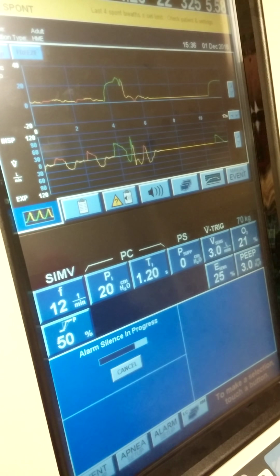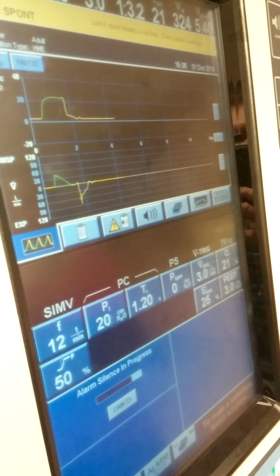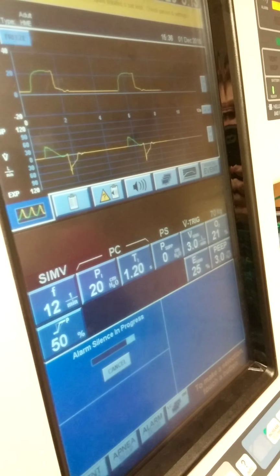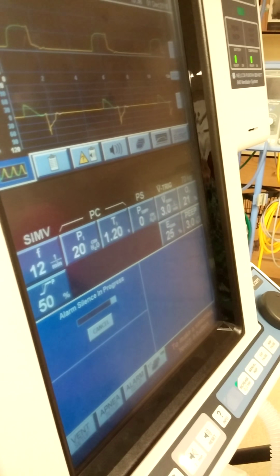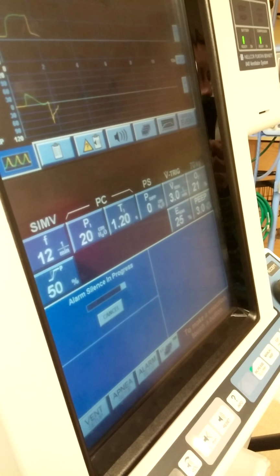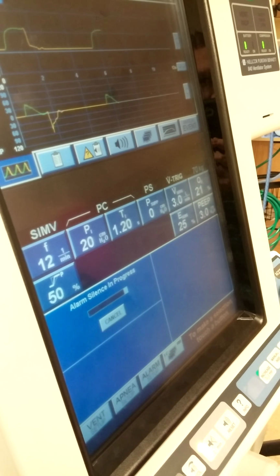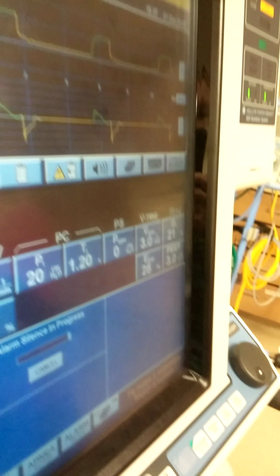Okay. The other thing is, as it transitions from P high back down to PEEP, if the patient happens to be taking a spontaneous effort, it just ignores it. So the patient could be taking a breath in, and all of a sudden the bottom drops out. And that can lead to some dysynchrony, be uncomfortable. Does that make sense? Yes. Because I'm able to breathe at that upper level. This is SIMV pressure control.